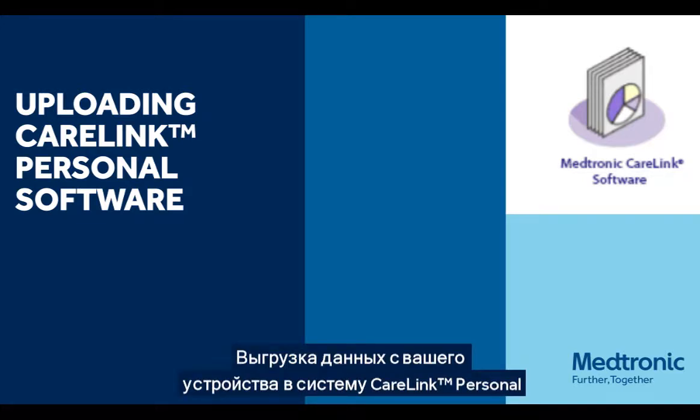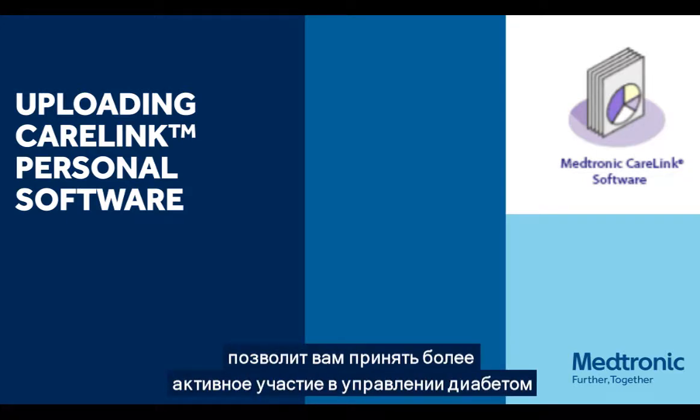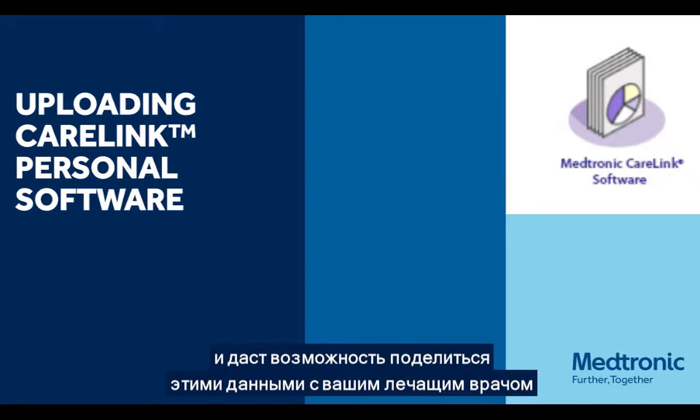Uploading your device data to CareLink Personal allows you to take a more active role in managing your diabetes and allows you to share your data with your diabetes healthcare team.